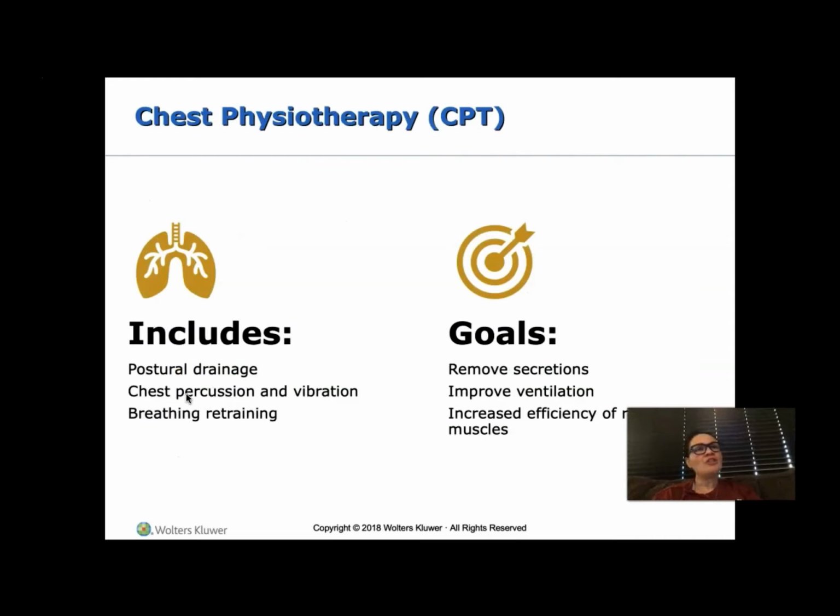All right. Chest physiotherapy. We toss this on here because this is one of the most common therapies, especially when somebody's going through some kind of bronchitis, pneumonia, surgery. You're starting to feel those lungs sounding moist before we get pneumonia, before we start having all this atelectasis. Maybe we do need that extra therapy. It's this vest across the chest they put on, and it vibrates, loosens up all that congestion in there.